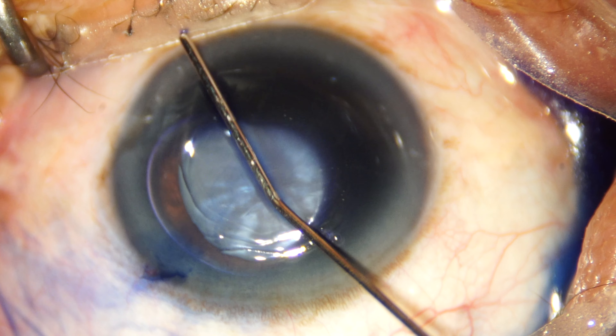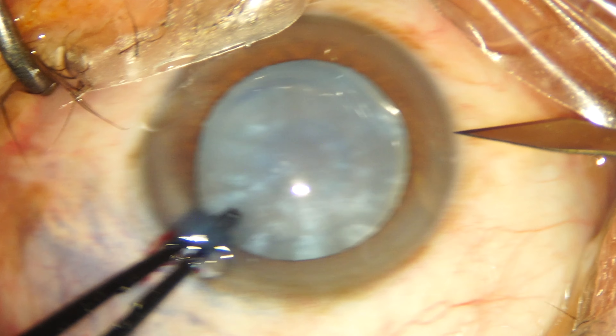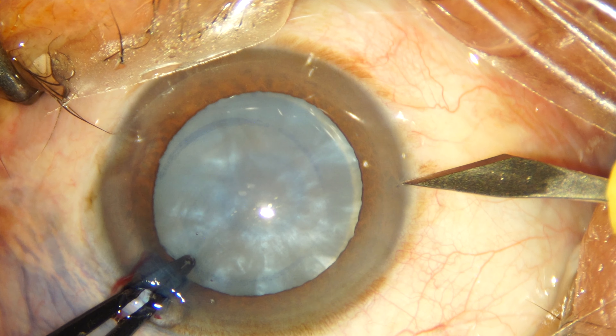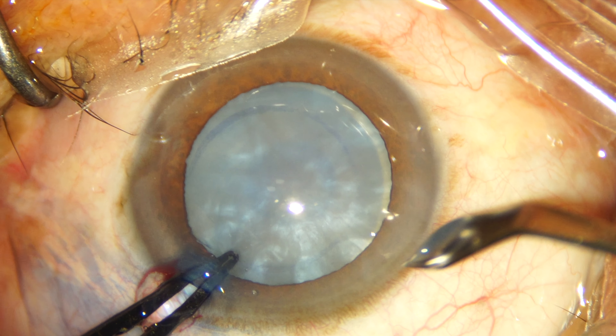Our patient has been given IV mannitol preoperatively to shrink the vitreous body. As we're deepening the anterior chamber with a cohesive viscoelastic, we notice that the convexity of the anterior capsule is reversed and it's become flat and almost concave. Nevertheless, the capsule rhexis is a very important step in an intumescent cataract and it has to be done very carefully.